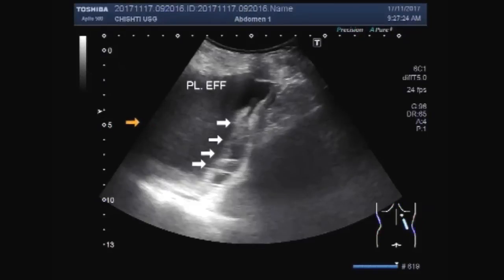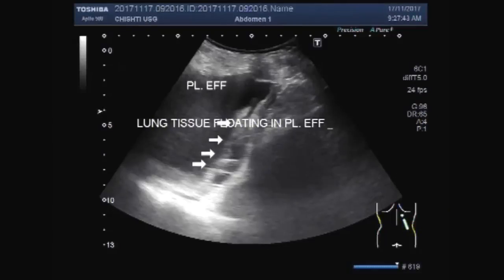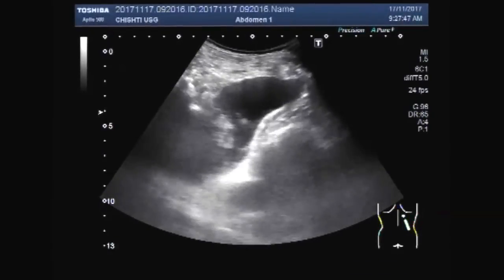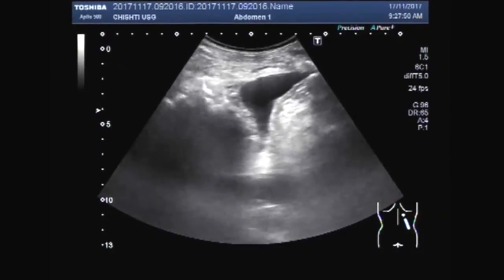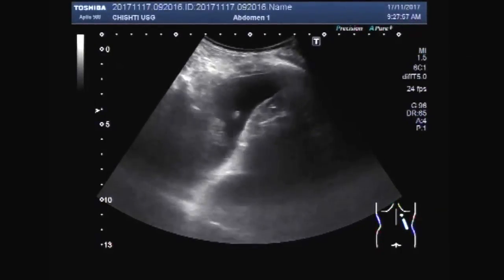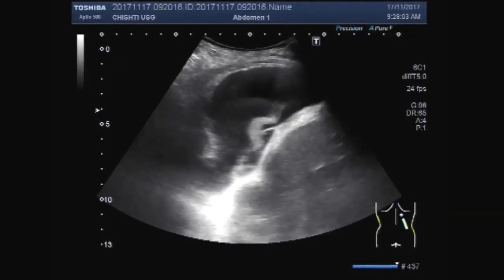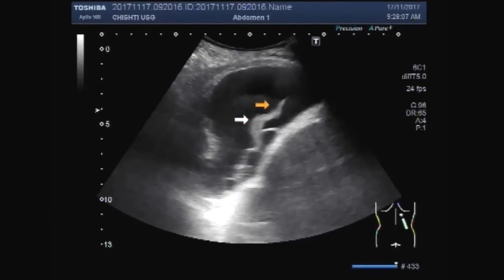The volume of the fluid is greater on the right side as compared to the left side. This is lung tissue floating in the pleural fluid. Again you can see — yes, this is collapsed lung tissue which is floating inside the pleural fluid.